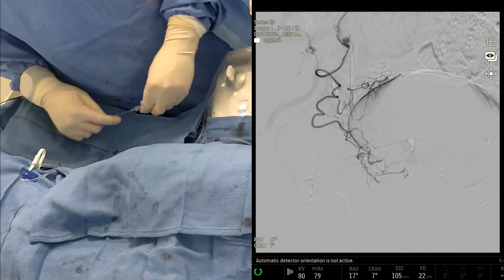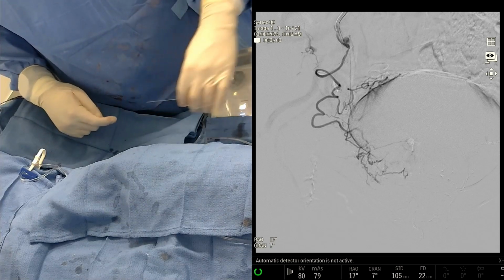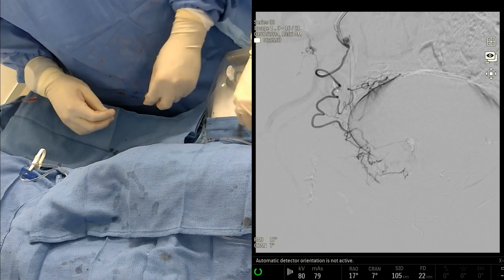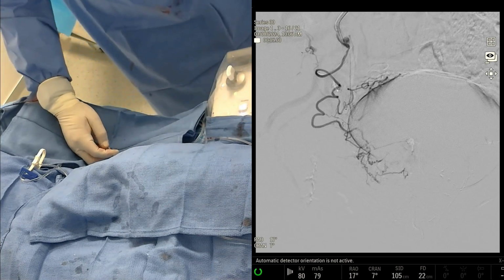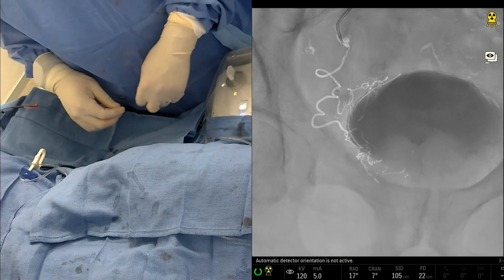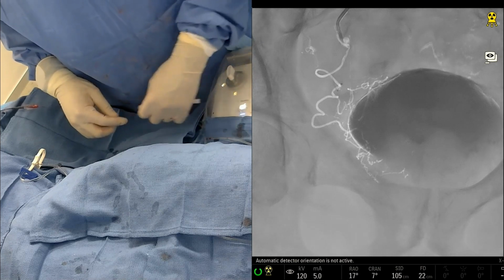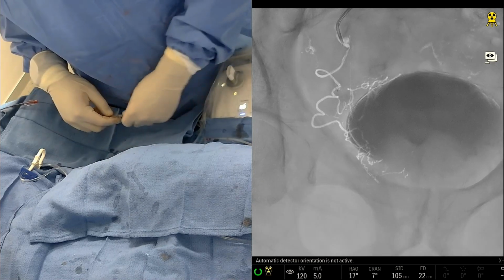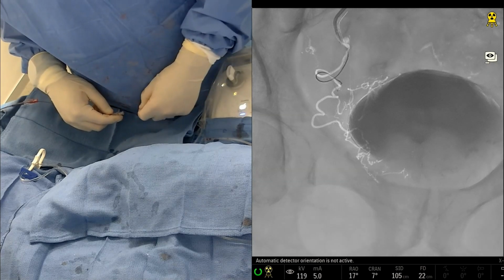And so I'm going to say today no, but if he doesn't get the best response in the world, we could consider it. But given that we see the majority of the prostate hopefully being treated after this injection, we'll probably just see how he does, and we'd have to bring him back to do that. In my experience, that's not going to be a significant contributor to his symptoms. Again, he's got severe IPP.